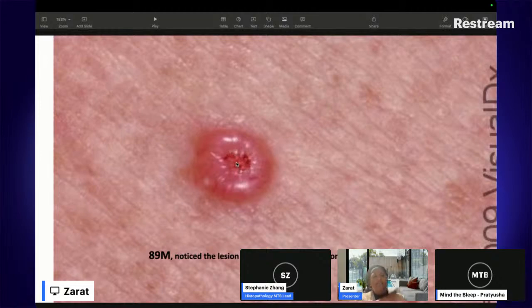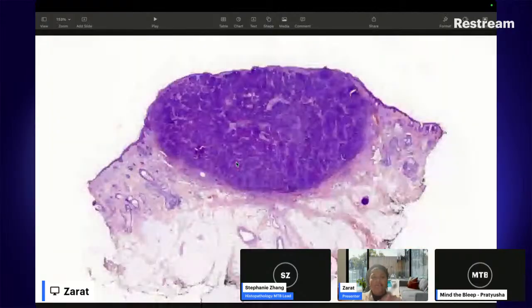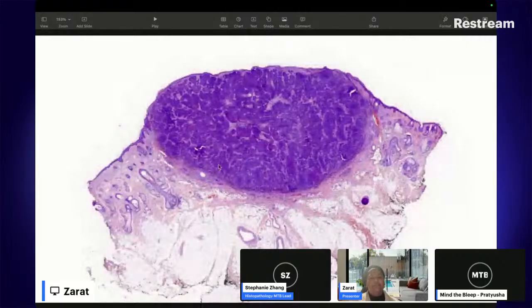This is a very typical description of what it is. I'm sure you've all read about it, but this is what it looks like under the microscope. So again, if we just stick to our map, the keratin layer at the top, fine, not to worry about.